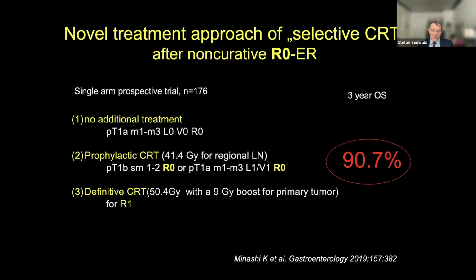So I think this is a very good question. You talk about these positive background colorations you see with NBI, and then finally the IPCLs are still normal. So I think if it is a low-grade dysplasia, you don't need to worry so much, because cancer also needs time to develop. And how to treat is also a question. I think you can follow up the patient in 6 months or 12 months. It is not a problem. You will not overlook a deep submucosal cancer.